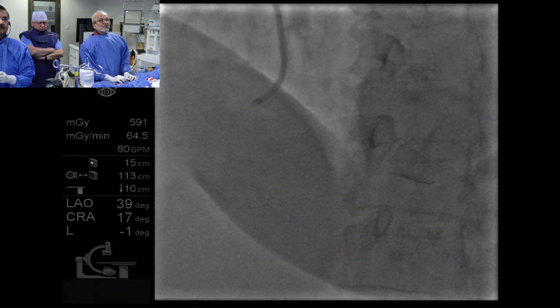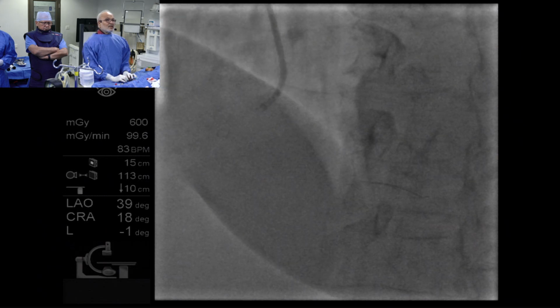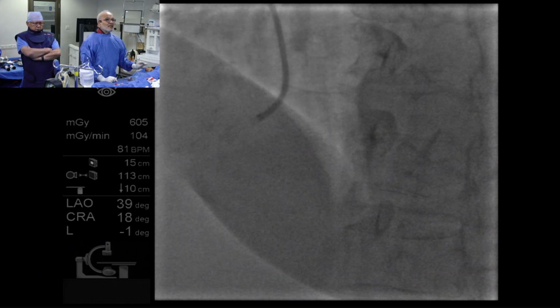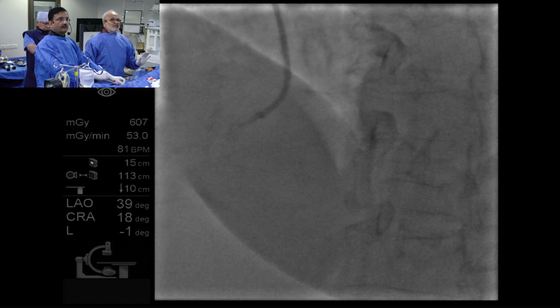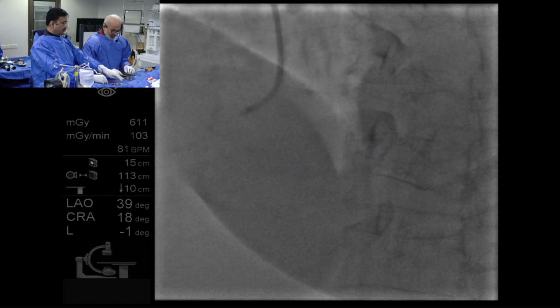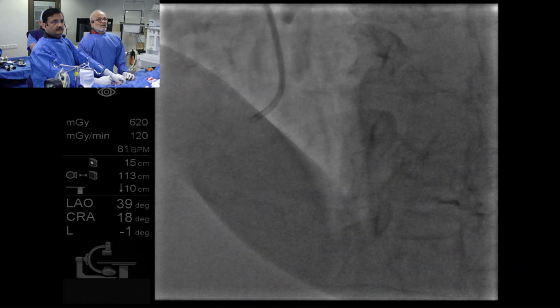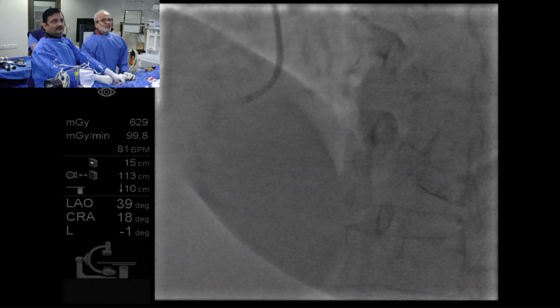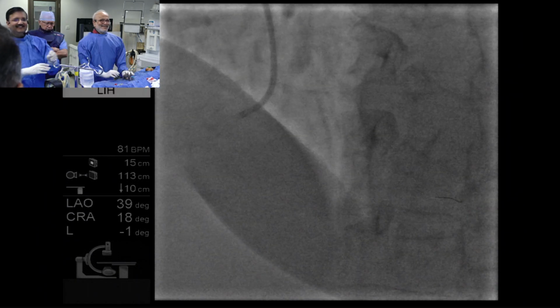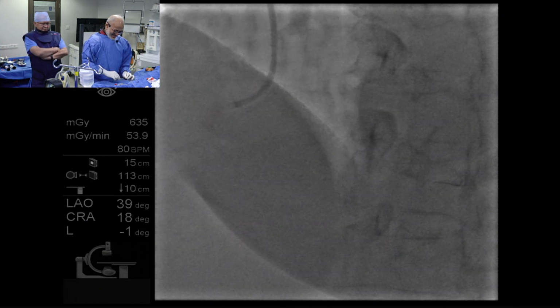We've had a new one for a long time and I still do that with my foot. Okay. Sanjay? Yes. Okay. Now let us check it with an injection. Everything is okay. Just a little bit of scout there. We have to go a little more in, a little more, giving a torque. Rota wire is very difficult, but I think you have beautifully entered that PDA. I am lucky, Tarun. Being a stainless steel wire, very difficult to torque.